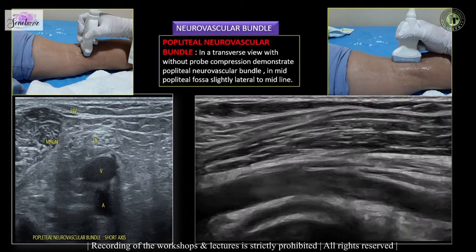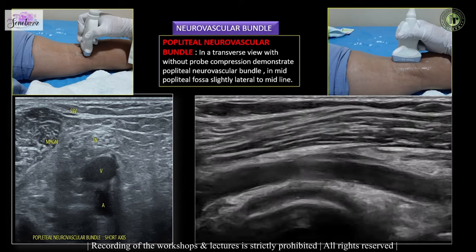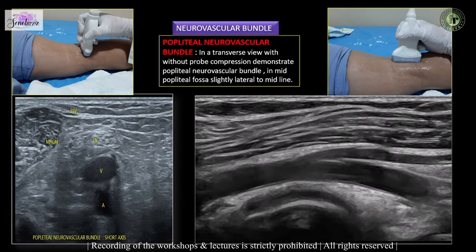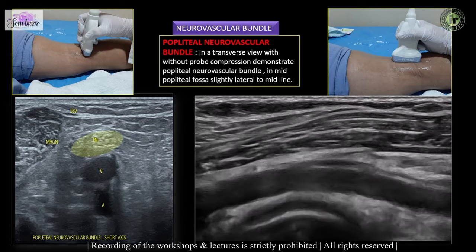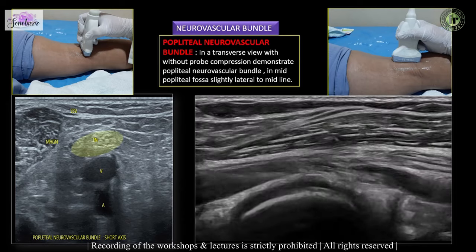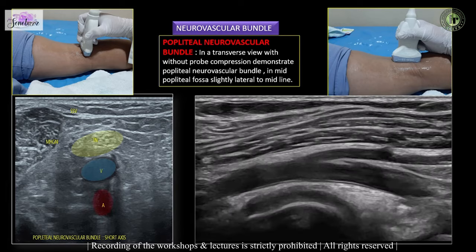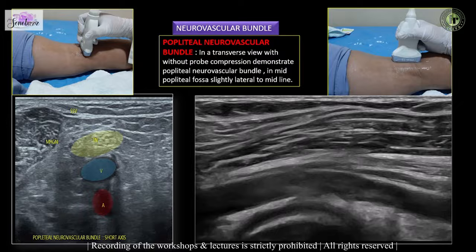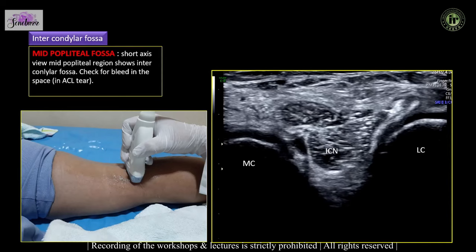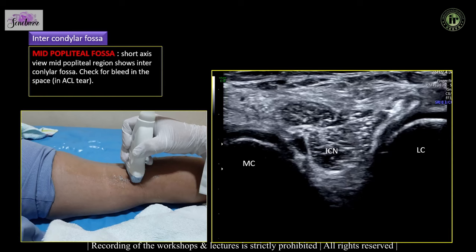The popliteal neurovascular bundle can be better demonstrated in short axis view on the posterolateral aspect of the knee, where we can demonstrate the posterior tibial nerve, popliteal vein, and popliteal artery from superficial to deep. The short axis view in the mid-popliteal region shows the intercondylar fossa, and in case of an ACL tear there may be bleeding or hematoma that we should look for.